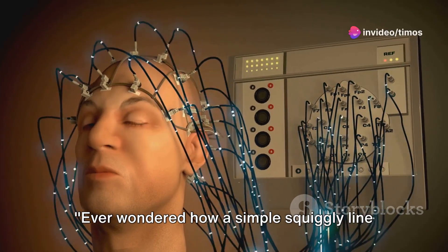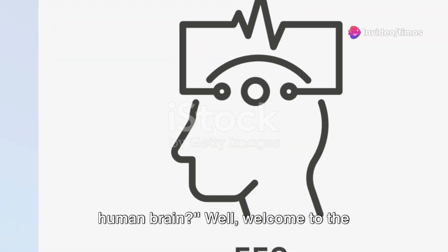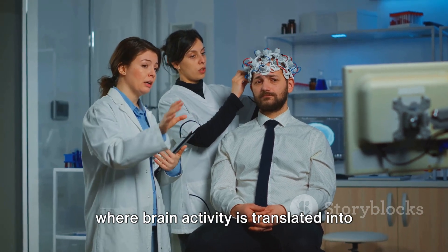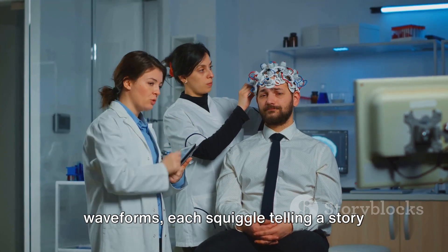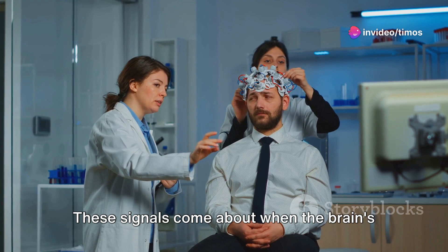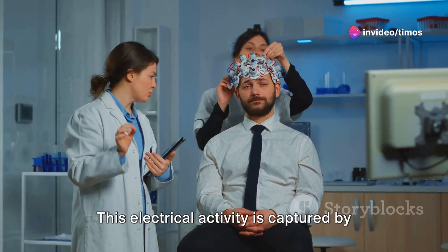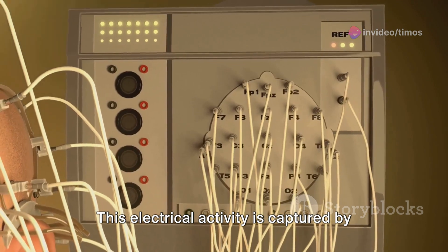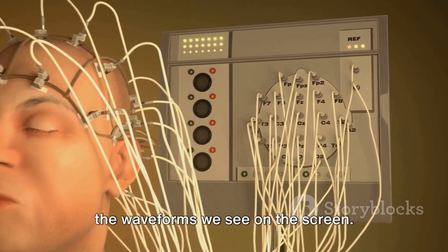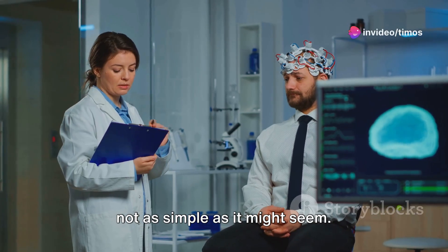Ever wondered how a simple squiggly line on a screen can unlock the secrets of the human brain? Welcome to the fascinating world of EEG signals, a realm where brain activity is translated into waveforms, each squiggle telling a story of neurons communicating. These signals come about when the brain's neurons send electrical messages to each other. This electrical activity is captured by electrodes placed on the scalp, creating the waveforms we see on the screen. Interpreting these waveforms, however, is not as simple as it might seem.